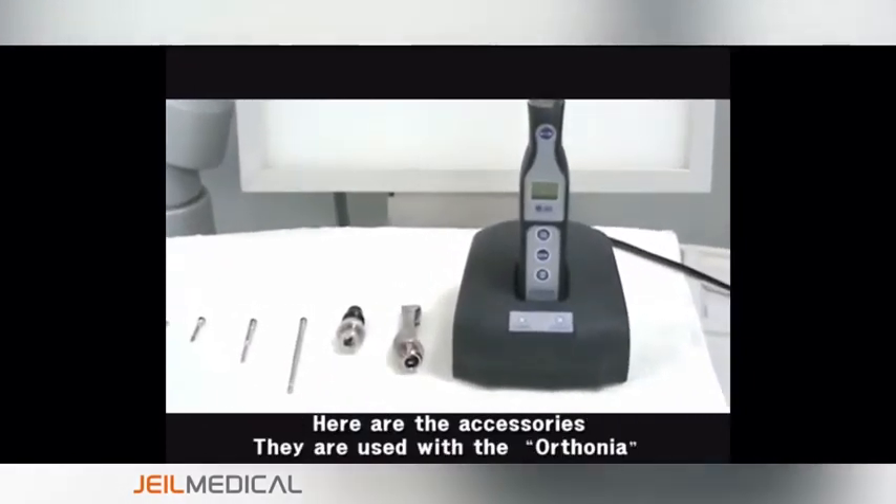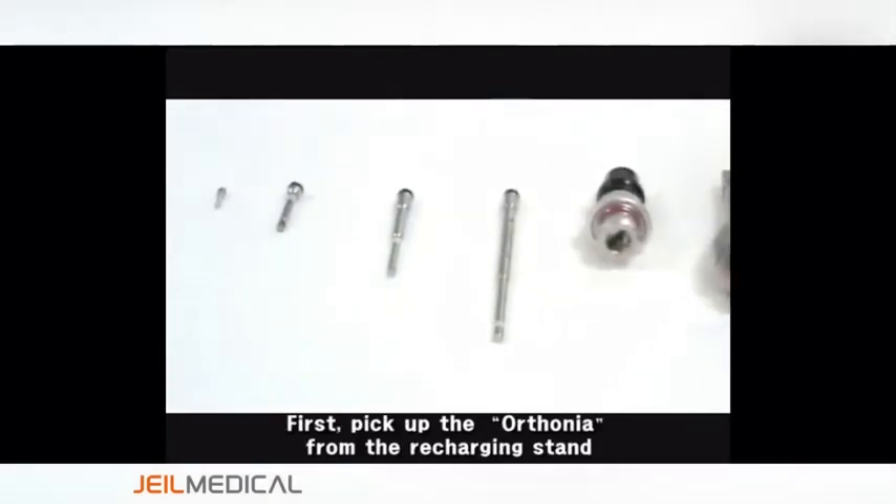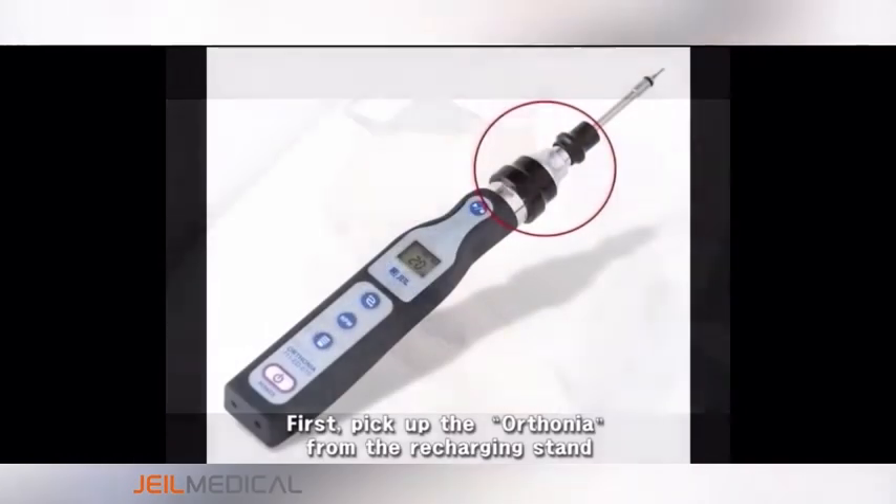Here are the accessories. They are used with the Orthonia. First, pick up the Orthonia from the recharging stand.